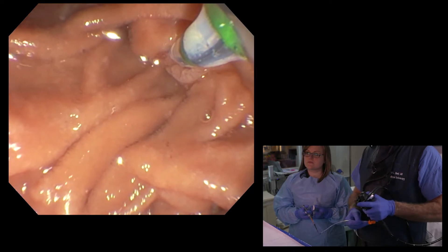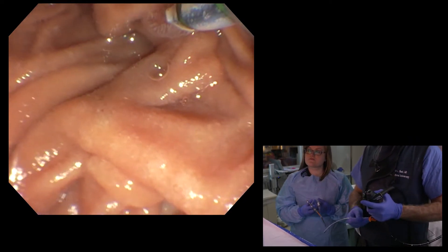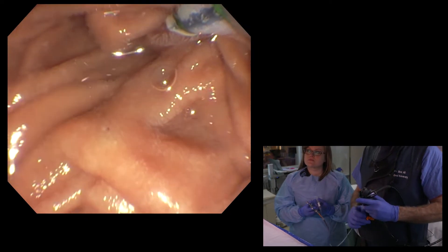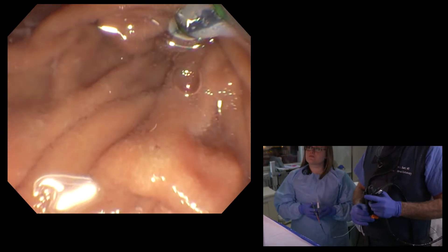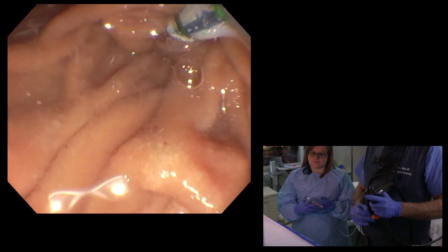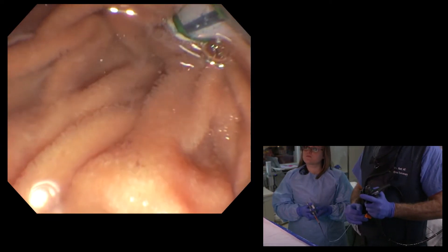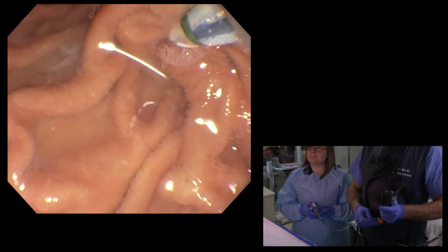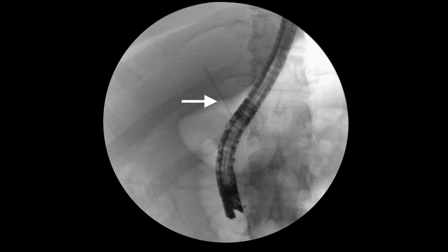One of the main principles in the current era of cannulation is the use of a wire to assist in cannulation. The catheter or sphincterotome is loaded with a hydrophilic guide wire, the orifice is engaged by the cannulating device, and once some degree of engagement is achieved, I'm gently pushing the wire to see if it's able to pass further up the duct. I push just hard enough to see if it's going to go, but not so hard that I push myself out. It's time-saving not to push too hard — I'm probing gently with the guide wire, basically trying to feel my way up the bile duct.